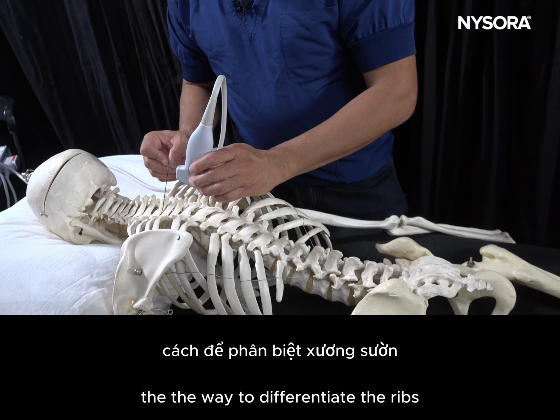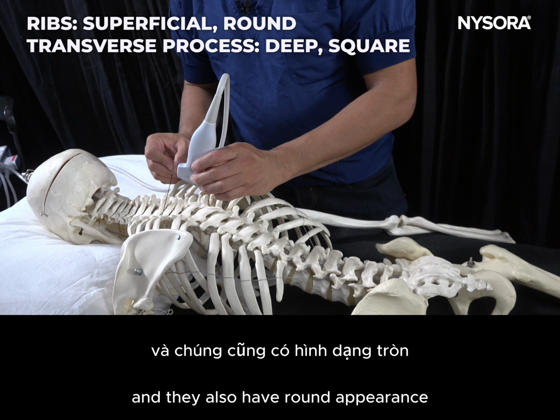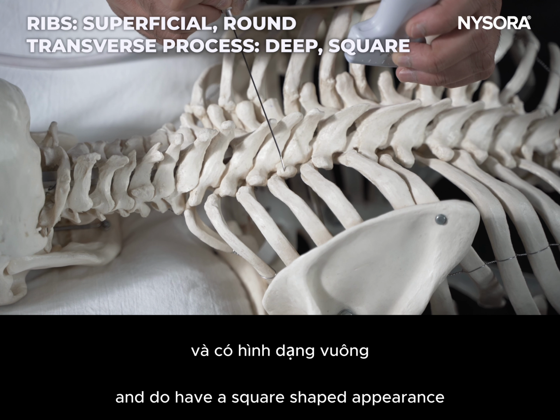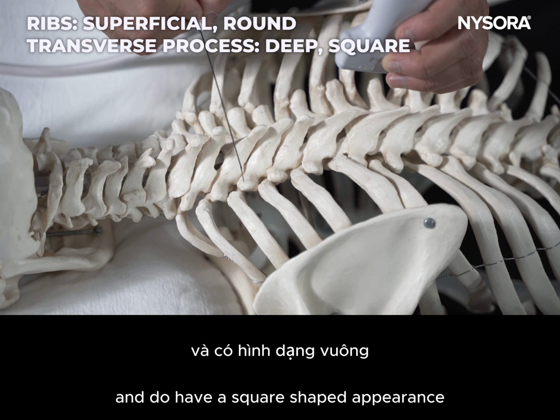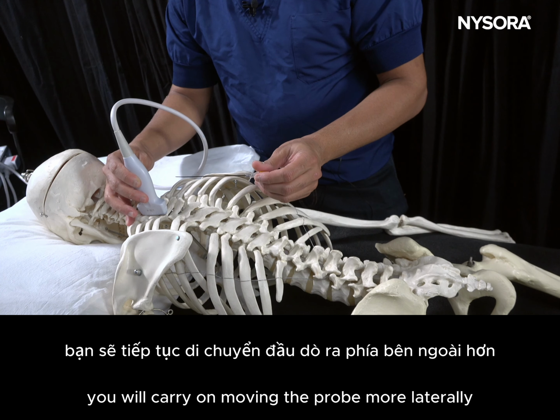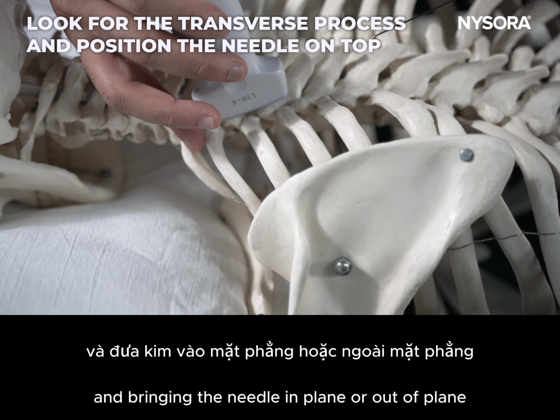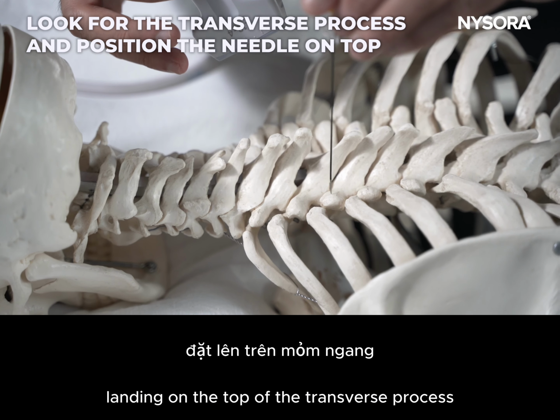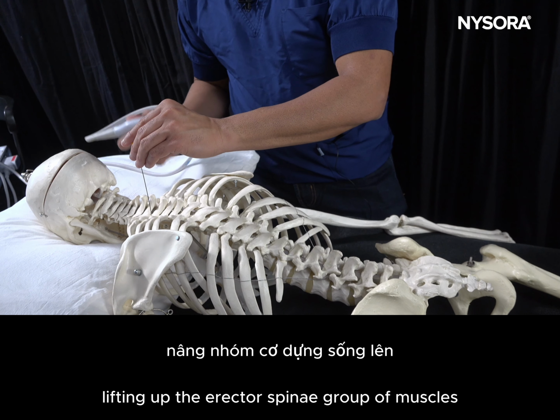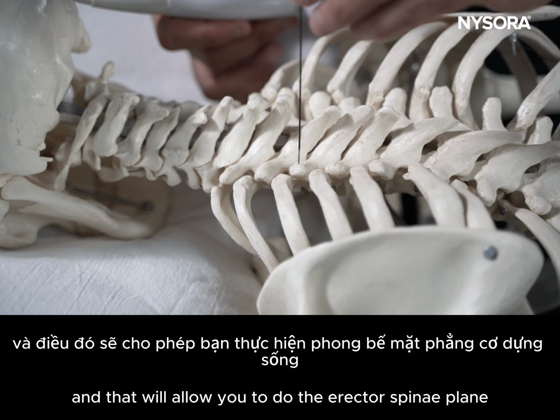The way to differentiate the ribs and the transverse process is that the ribs are superficial structures and they also have a round appearance, as compared to the transverse process, which is slightly deeper and has a square-shaped appearance on the ultrasound. To perform an ultrasound guided erector spinae block, you will carry on moving the probe more laterally, looking for the transverse process and bringing the needle in plane or out of plane, landing on the top of the transverse process, lifting up the erector spinae group of muscles and injecting the local anesthetic and steroid mixture, and that will allow you to do the erector spinae plane block.